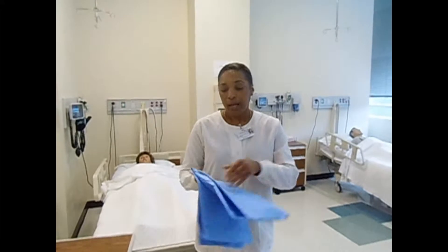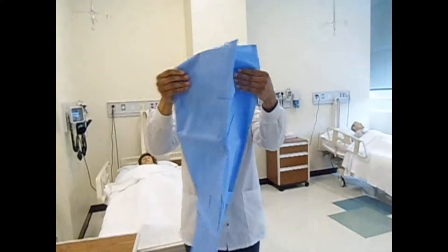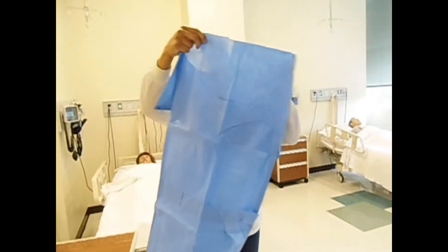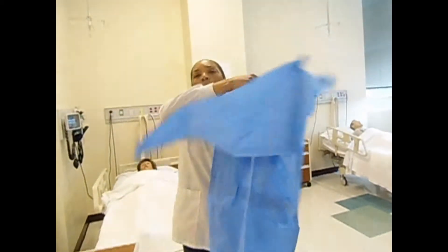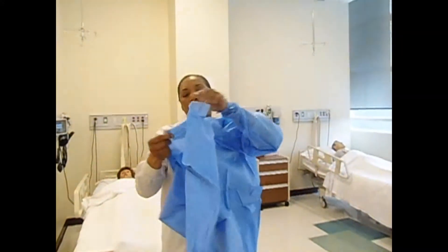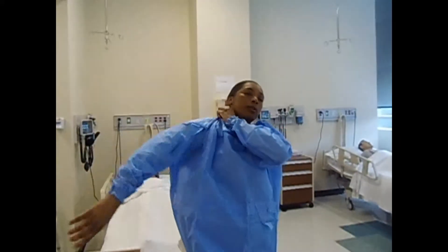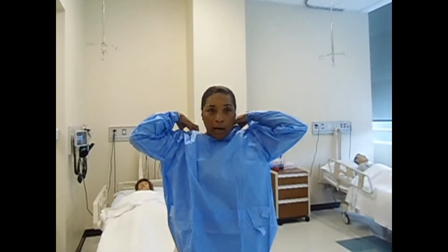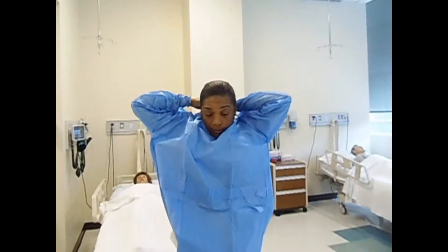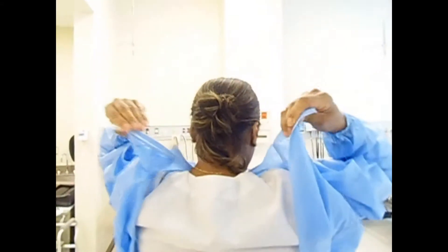Go ahead and unfold the gown, making sure you are not shaking it at all. Starting from the top, put your arms through the gown — do not let the gown touch the floor. Put your arms into the sleeves; it doesn't matter if you insert the left or right arm first. Pull the gown up. Some gowns have a tie at the neck or back, at the waist, and some ties come with velcro, just like this gown.